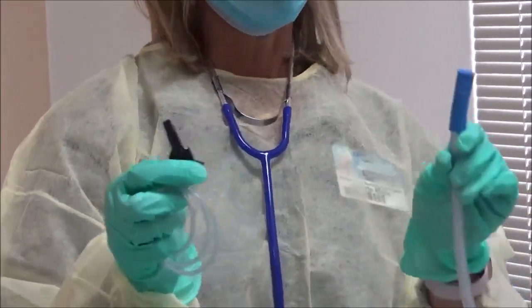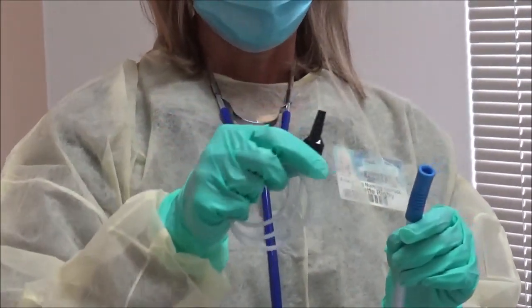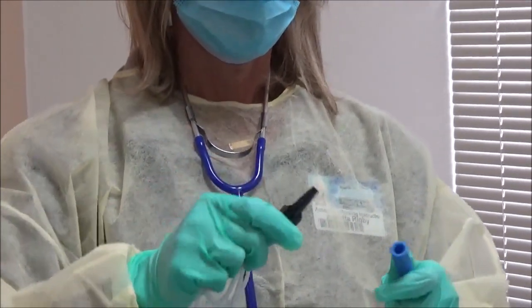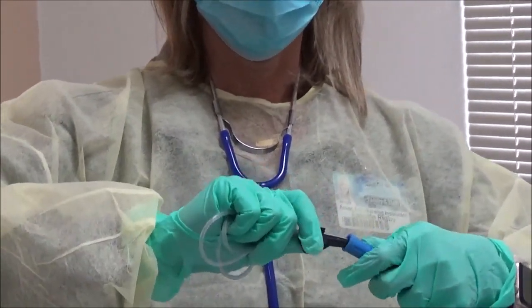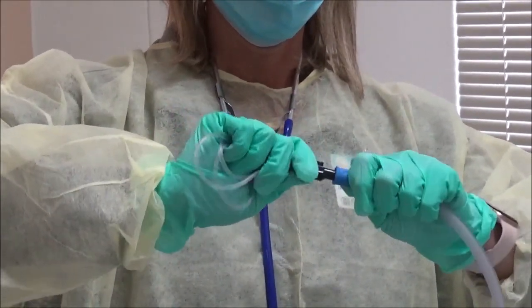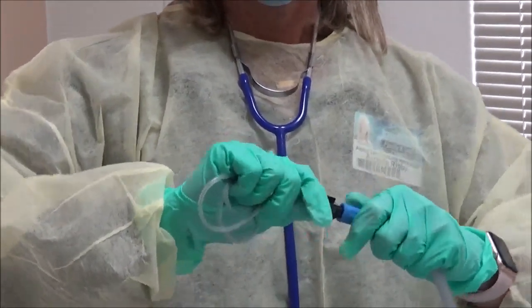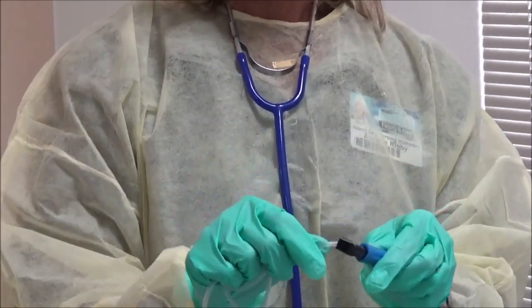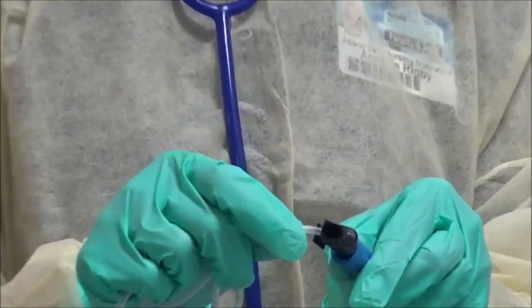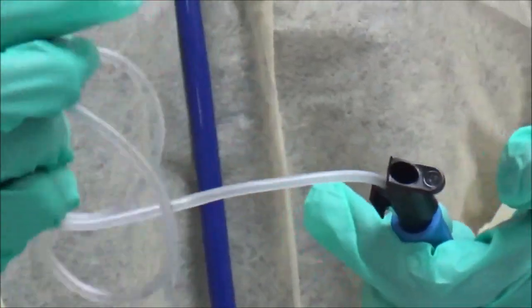But this is not sterile. So when I connect these two together, the black part of this tubing is going to become contaminated because it's touching something that is contaminated. But I want to make sure I don't contaminate my right hand. Connecting that together. And if you'll notice, on this suction catheter, there is an opening that controls my suction. That's what I'm going to use now to control my suction.